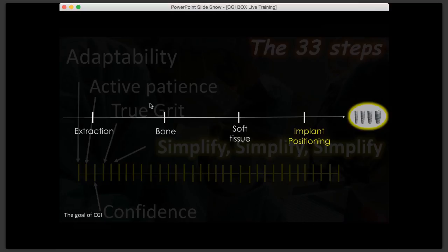Can guides be inaccurate from time to time, and you need to abandon the implant placement? Yes, absolutely. I've had cases where I needed to abandon the implant placement. I abandoned because if I am missing accuracy with a plan, I'm not going to continue with a bad plan, if you know what I mean. Which happened this morning.